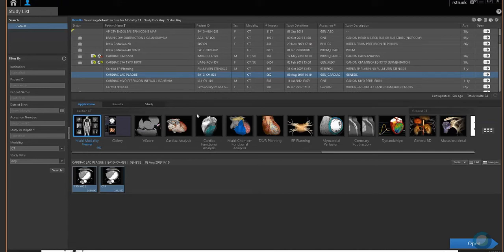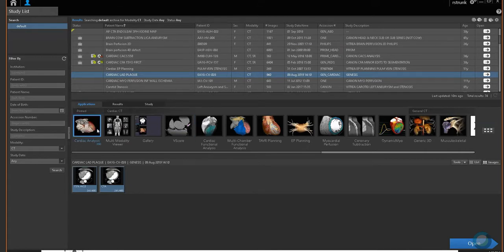After selecting the patient, Cardiac Analysis is the application you want to use. When you log in yourself, if you do a right mouse click and pin that application, it'll always be one of your favorites — right over here on the left-hand side — so you don't have to look through all the different applications. Select your patient, select the application, and select your series.